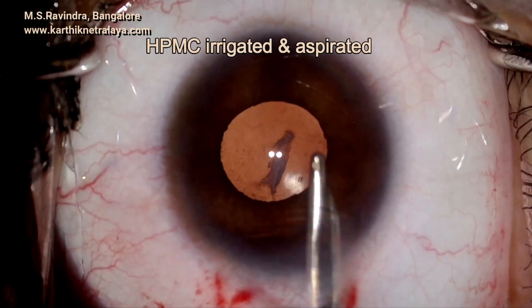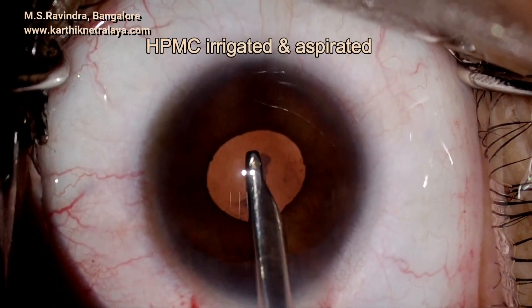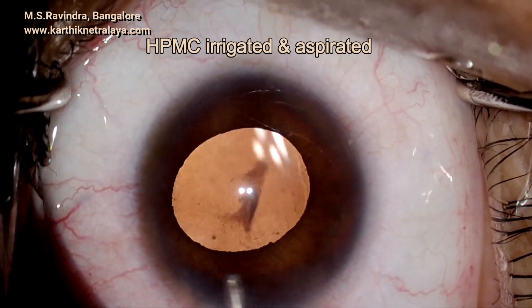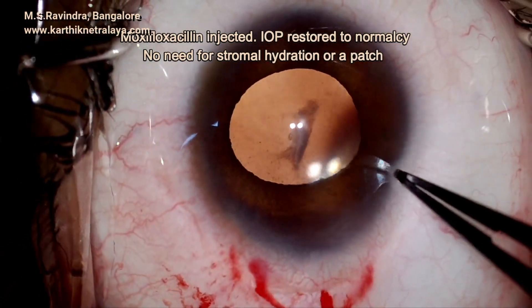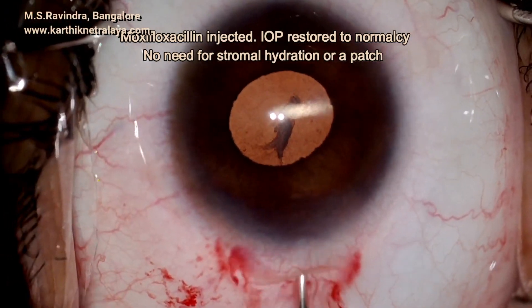Intraocular pressure is restored by balanced salt solution and the pressure is now normal, as you can see. A small amount of antibiotic is injected into the anterior chamber and that is the end of the surgery.